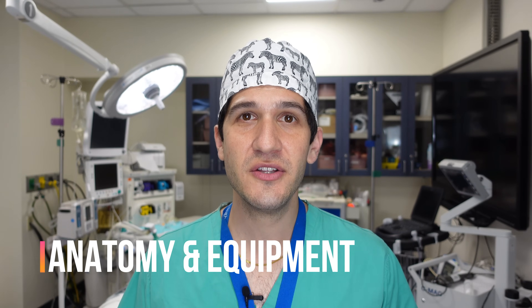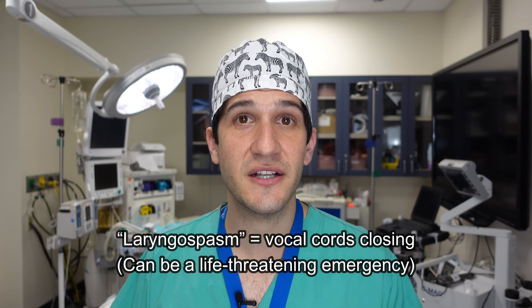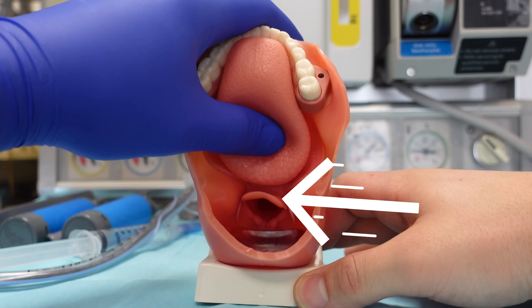When we're talking about intubation in anesthesiology, we're typically referring to endotracheal intubation — meaning using an endotracheal tube such as this and passing it through the vocal cords, represented by my fingers. The reason we would want to do endotracheal intubation is so that we can control a patient's breathing using our ventilator, as shown behind me. Because vocal cords can close shut, particularly in an unconscious patient, we want to have our endotracheal tube pass the vocal cords so that we don't have them as an airway obstruction. As you study airway anatomy, one of the most important structures from the anesthesiologist's perspective is the epiglottis — a cartilaginous piece of tissue that sits just above the vocal cords and keeps them protected. When performing endotracheal intubation, the epiglottis can obstruct your view of the vocal cords, so intubation devices are designed to get us around the epiglottis.